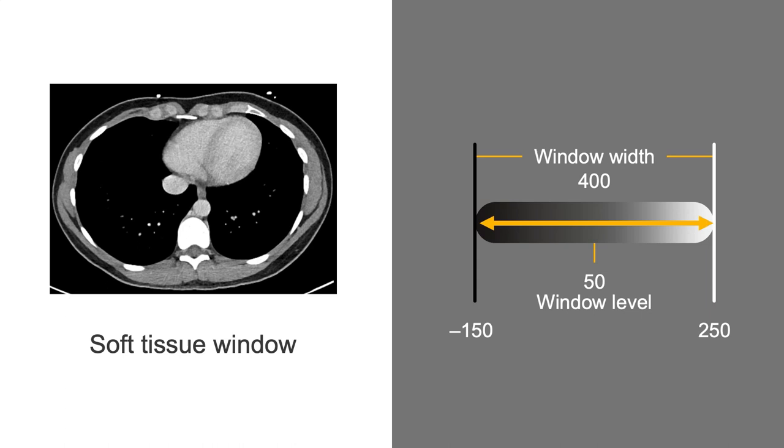Everything with a Hounsfield unit value below –150 will appear black, and everything with a Hounsfield unit value greater than 250 will appear white. These window settings concentrate the grayscale differences over soft tissue structures. Remember, the center point is 50, right in the soft tissue range.